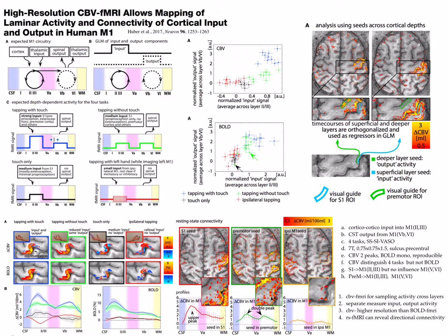I won't talk about this in detail. You can refer to another paper published by Huber. But using this method, he can measure both task functional MRI and resting-state functional MRI. For the task MRI, he invented 4 tasks.